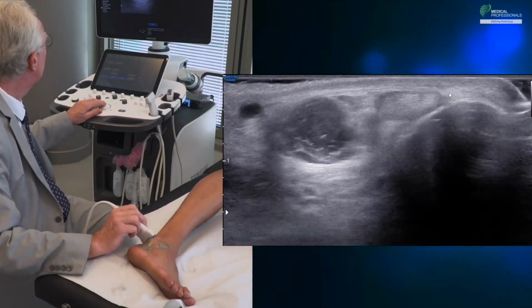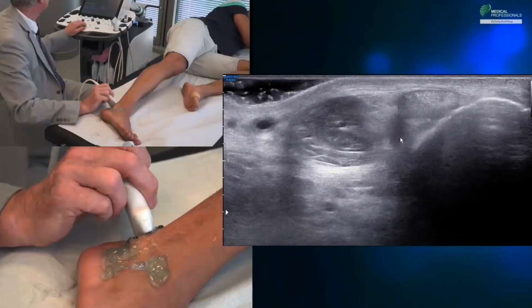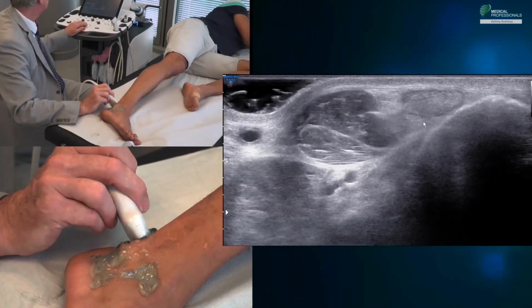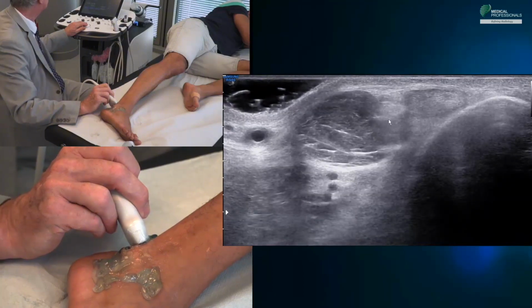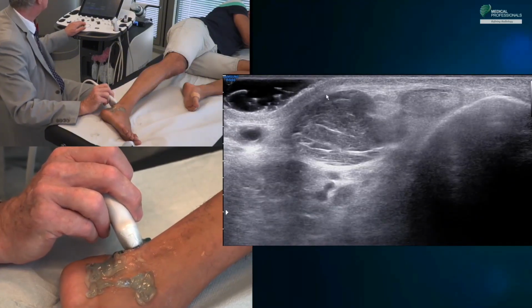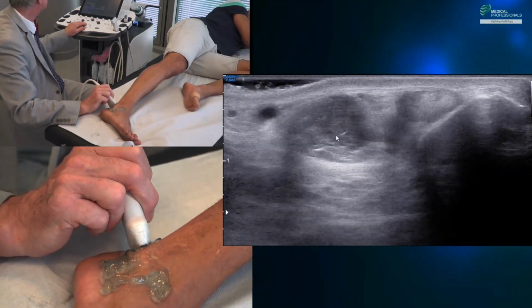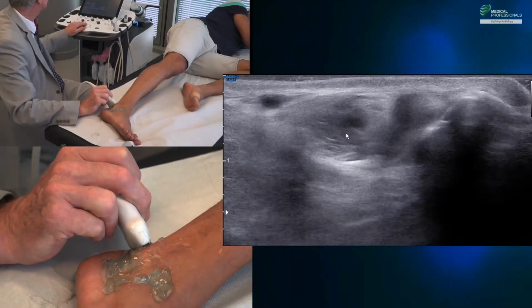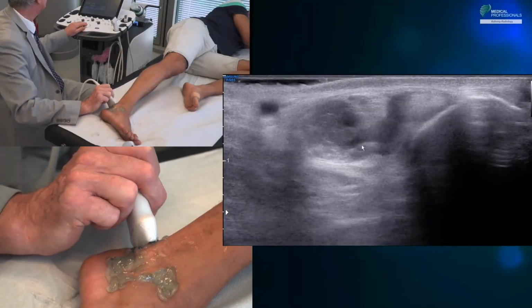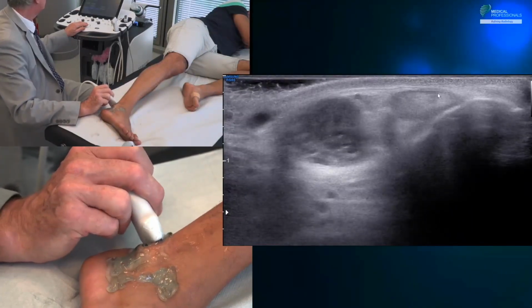The second one is the accessory tendon, the peroneus quartus. Here we see that there are only two tendons, peroneus longus here and peroneus brevis here, with its muscle developed posteriorly. Well, this muscle, which is very clearly hypertrophic in this patient, and that descends relatively low, may constitute the third element to look for in the event of retromalleolar pain of fibular origin.